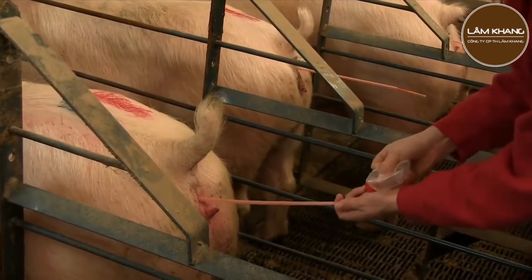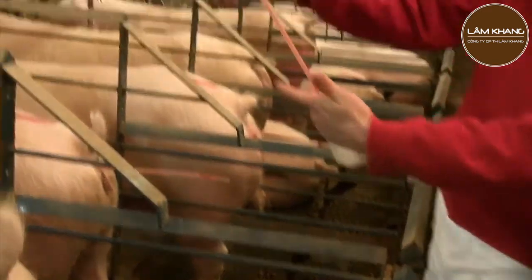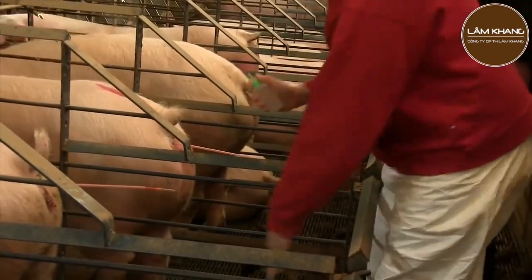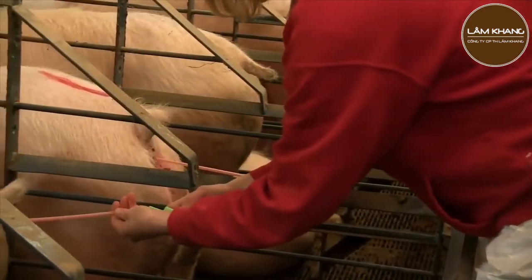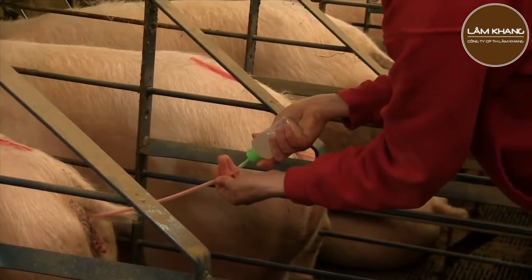Once the complete dose is deposited, you can remove the inner and outer catheters simultaneously and examine them for any leakage or blood. When you remove the catheter, backflow should be minimal. In other words, the sow should not squirt the semen back out her vulva onto the floor.